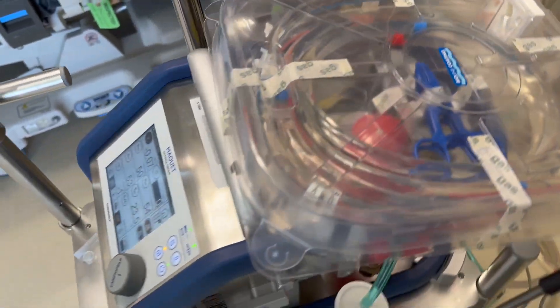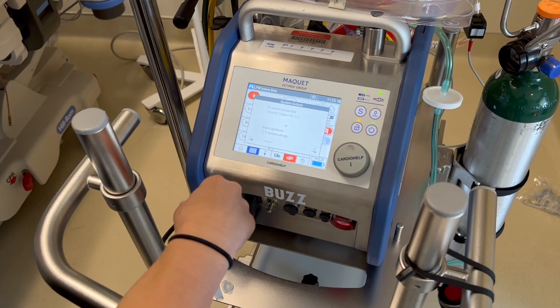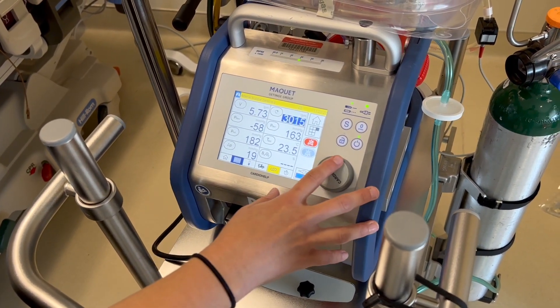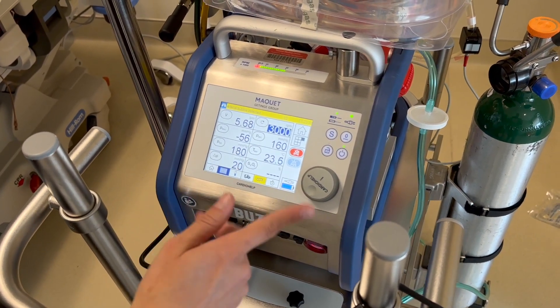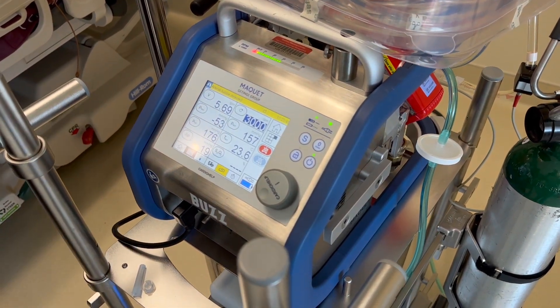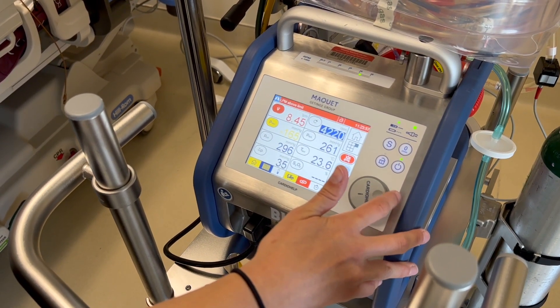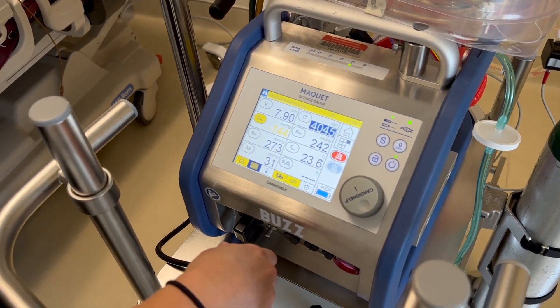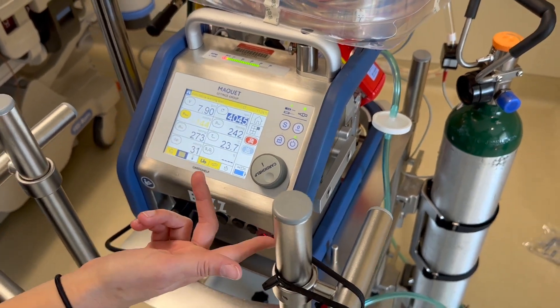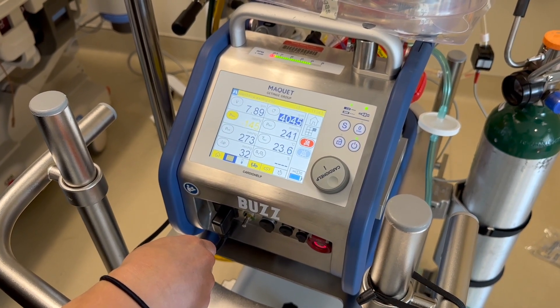Now the passive prime is done and the oxygenator is full. We're going to increase our RPMs to 3,000 for two minutes. You may have to unlock your screen first. It doesn't have to be exactly 3,000 — a little over or under is fine — but you want those RPMs up. You should not hear any more bubbles. Once your two minutes is up, increase to 4,000 for one minute. If you're still hearing air — remember air sounds like bacon — repeat both processes: 3,000 for two minutes, then 4,000 for one minute. Once you hear no air, turn your RPMs down to zero.